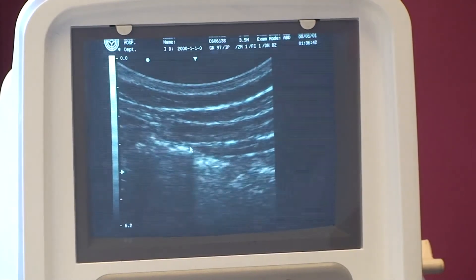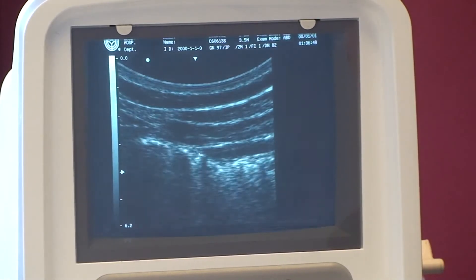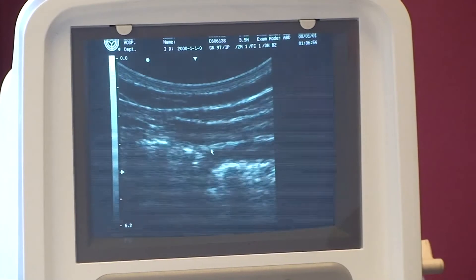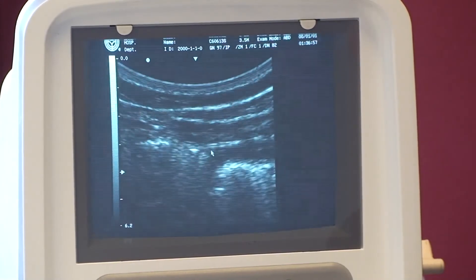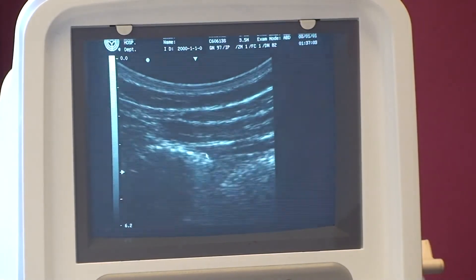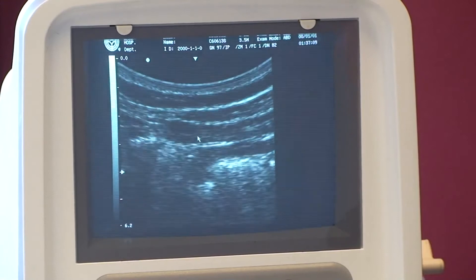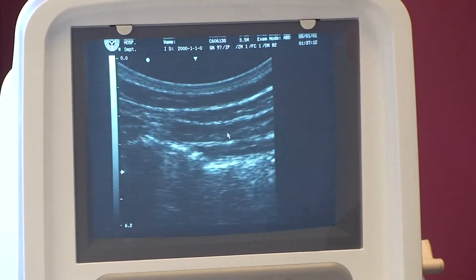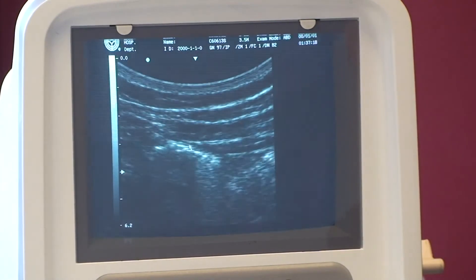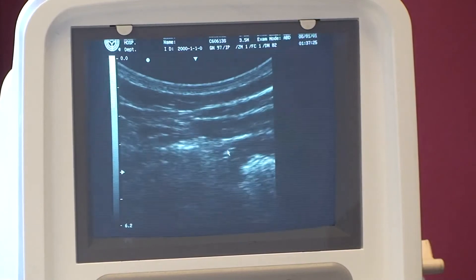Alex, take a breath in, breathing out. And to a count of five, we just want a small slide of TA. Maintain that. I've got my hands on him checking that he's not using external or internal oblique. We've still got a bit of excessive contraction — he's still bracing a little bit. Relax. You'd want to do this four or five times and compare the right side with the left. So to be clear on what we're looking at: external, internal, and we're looking for the fascial slide — just a small fascial slide, not a quick flick. Do it the wrong way again so we can see the comparison: that's bunching them all together.